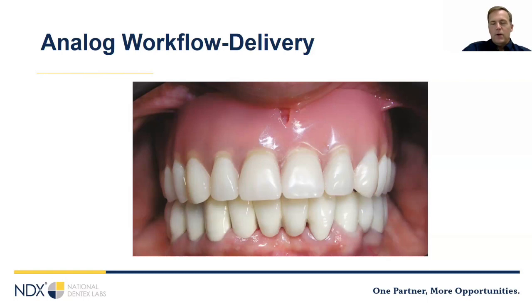Sometimes it stinks, but you have to realign your brand new denture just because it's not fitting quite the way you want. The other thing that can be a challenge is even when our laboratories follow the correct procedures, there's quite a bit of force involved in injecting or packing a denture, and sometimes the teeth can move. And so it can be a little bit frustrating for you guys, I know, because you're like, well, the setup looked great, but the denture not so much.